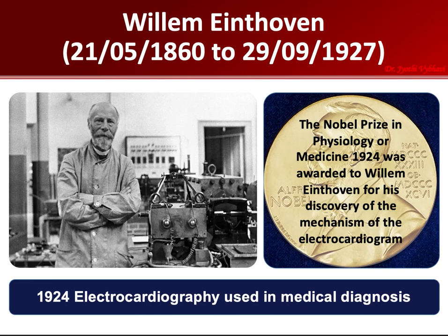Around 1900, you can imagine it is 120 years ago, he devised the first string galvanometer, known as the Einthoven galvanometer. With this instrument, he was able to measure the changes of electrical potentials caused by heart muscle, and he recorded graphically all these changes happening in the heart, and he coined the term ECG, that is electrocardiogram, for this also.